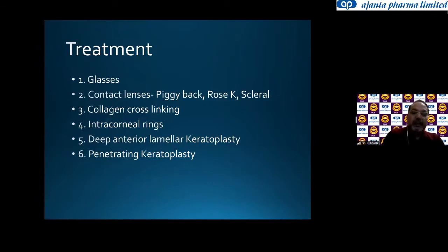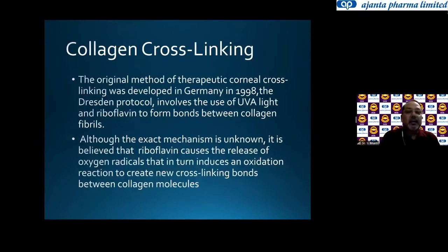but I'll take the new collagen cross-linking in my talk. And this is the original method. Therapeutic corneal cross-linking was developed in Germany in 1998. The Dresden Protocol involves the use of UVA light and riboflavin to form bonds between collagen fibers. And the exact mechanism, though, is unknown.